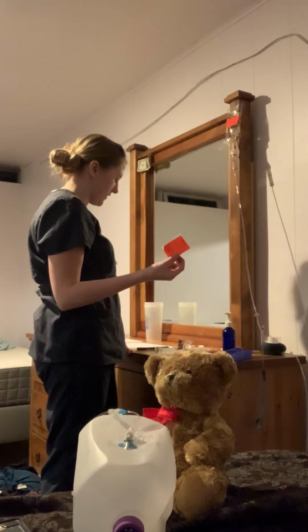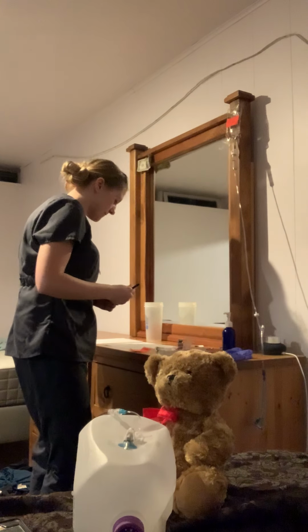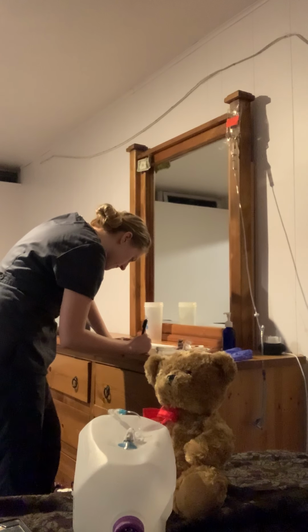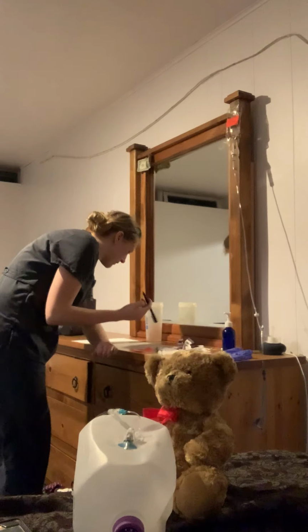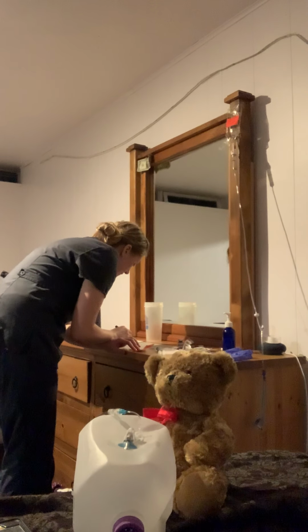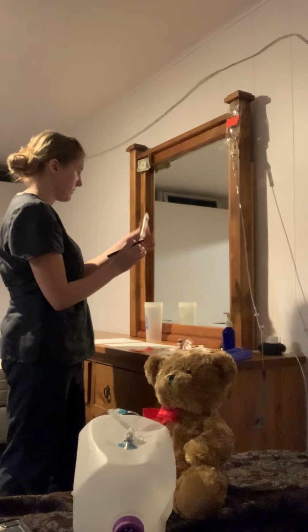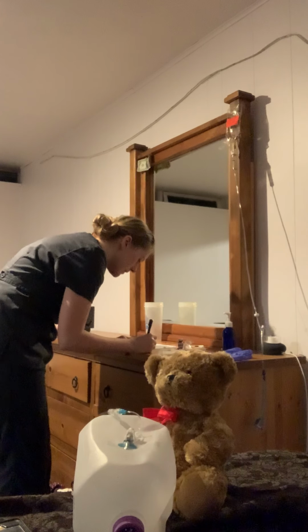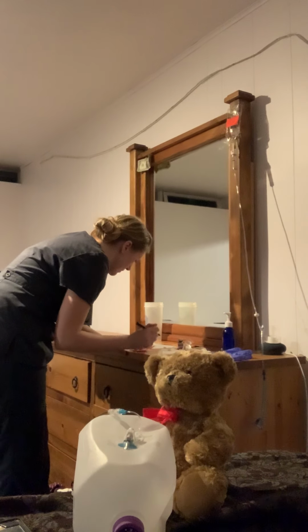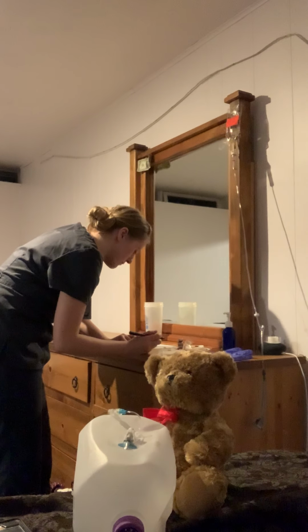So this time I'm going to fill out my sheet for the needle here. So our patient name is Teddy Bear. And again, comparing with MAR is furosemide, 40 milligrams, and that's 4 mils. So again, we have 4 mils. The time, 2200, we'll give this at. And the reason we're giving it is fluid overload.